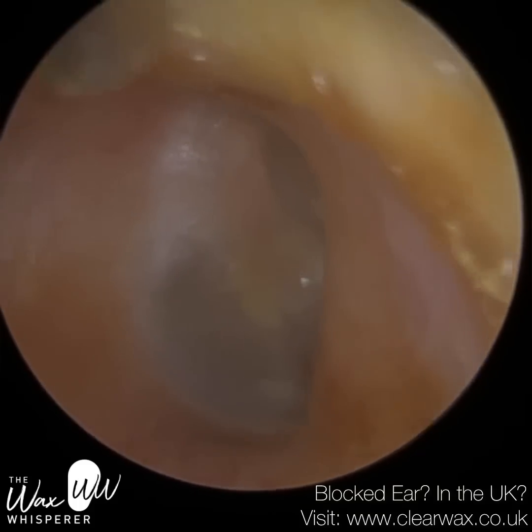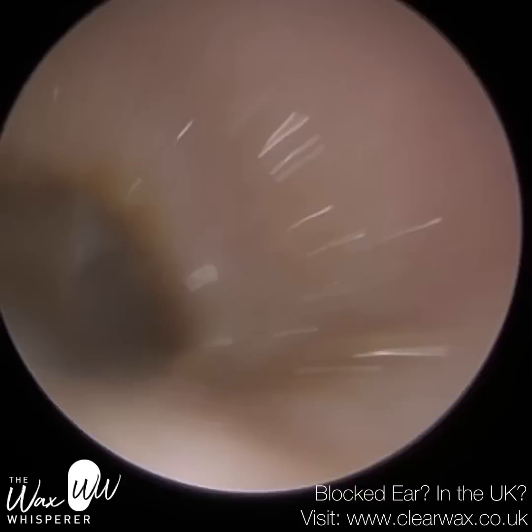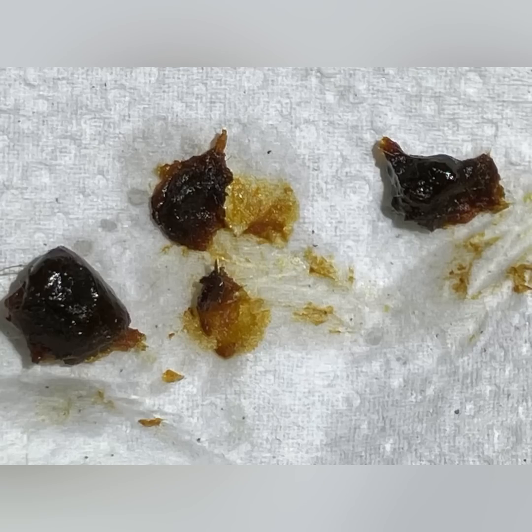And in a moment you will see some still images, and they're going to pop up now. So when I'm cross-referencing it to my table, it's definitely type 5, this.